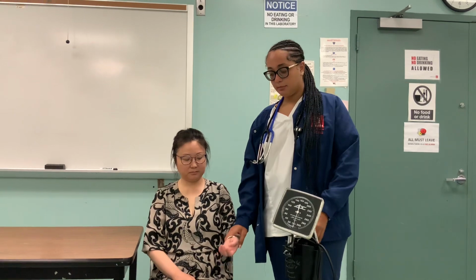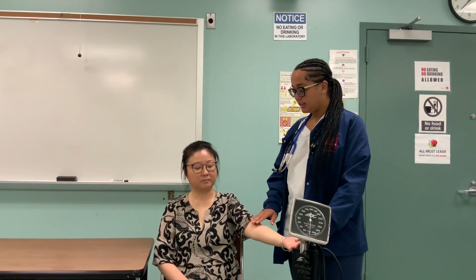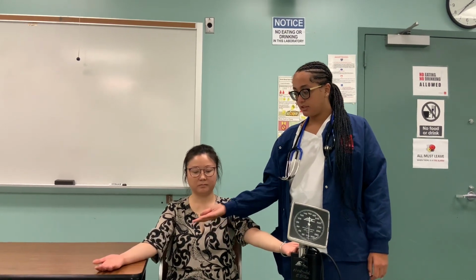When measuring blood pressure, you always want to start by making sure your patient is in a comfortable position. So if you're taking blood pressure on this side and they're comfortable with keeping their arm on the machine, as long as their arm is straight, palm up, and aligned with their heart, this is fine. And if they prefer to have their arm resting, they could place their arm on the table with their palm facing up, as long as it's more so straight and aligned with their heart.